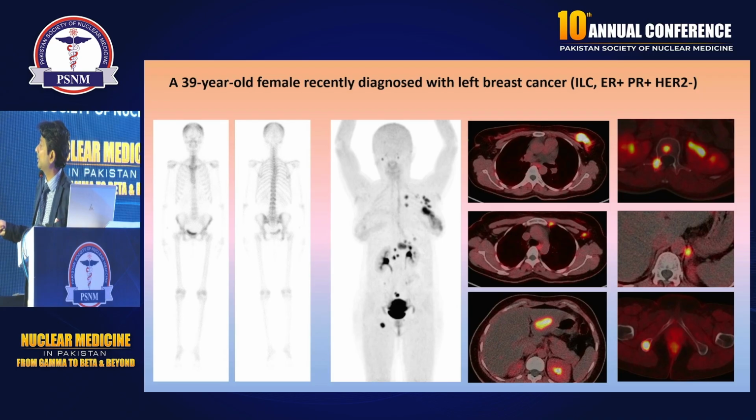You can see this patient has a very extensive mass with level 1 to level 2 lymph node and internal mammary involvement. Plus the patient has liver involvement and multiple bony lesions, and additionally there is an adrenal lesion as well. So totally changed. This patient becomes stage 4 and goes for palliative chemotherapy.